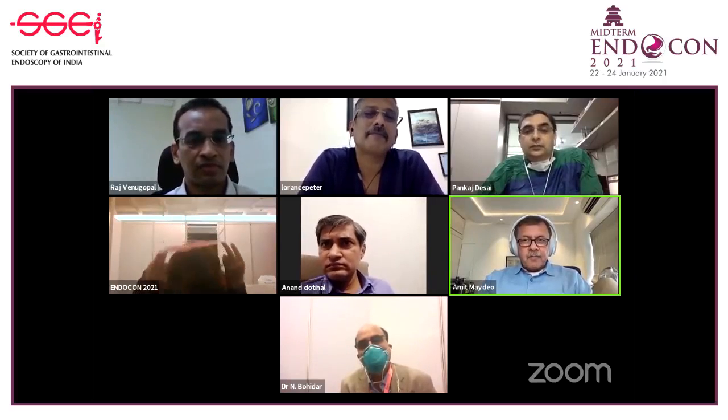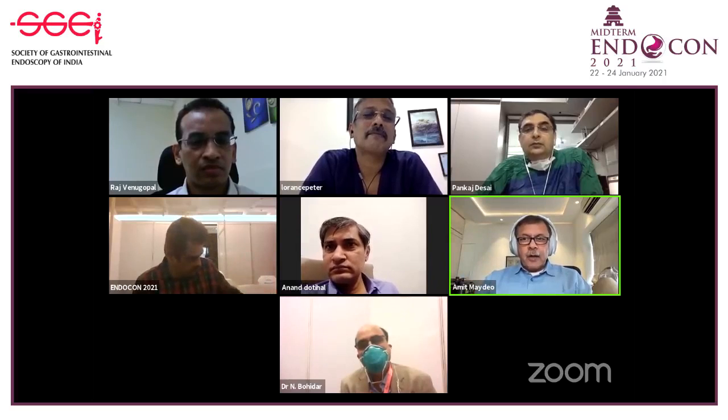To tell you the truth, in our country, we don't see too much of reflux. I started POEM in October 2012. In fact, I was the first to do POEM in the country. And from that time, only when people started making noise about whether reflux will kill POEM, we started thinking about it too much. We started performing these pH studies, and we became a little bit more sensitive, but otherwise it was not required.